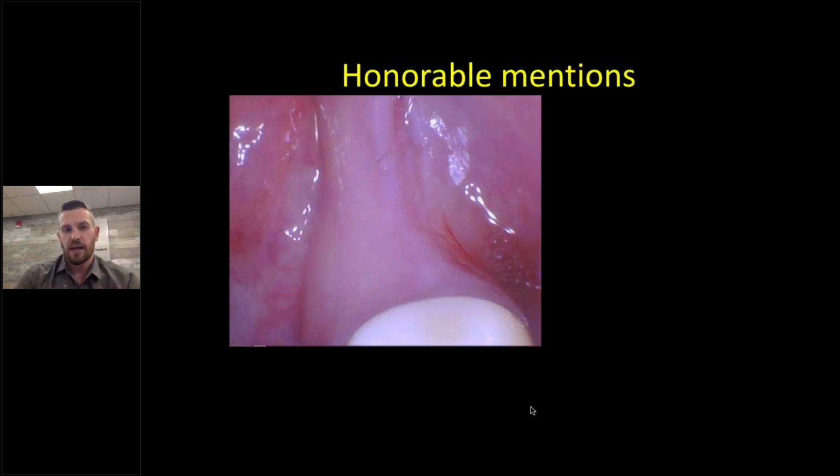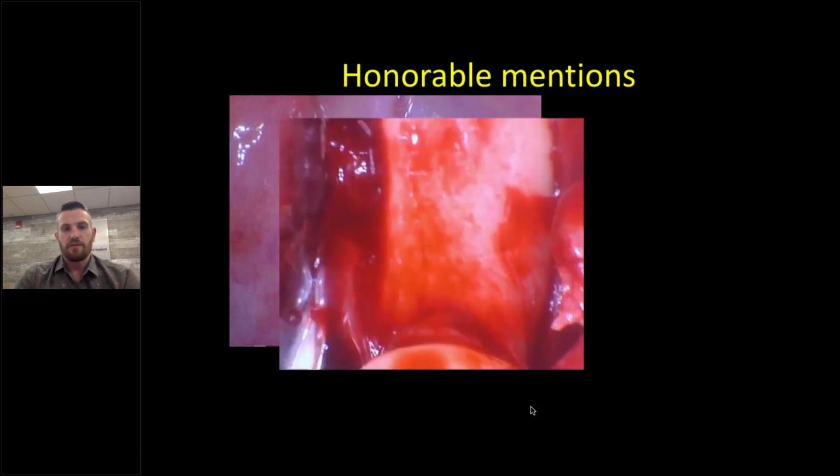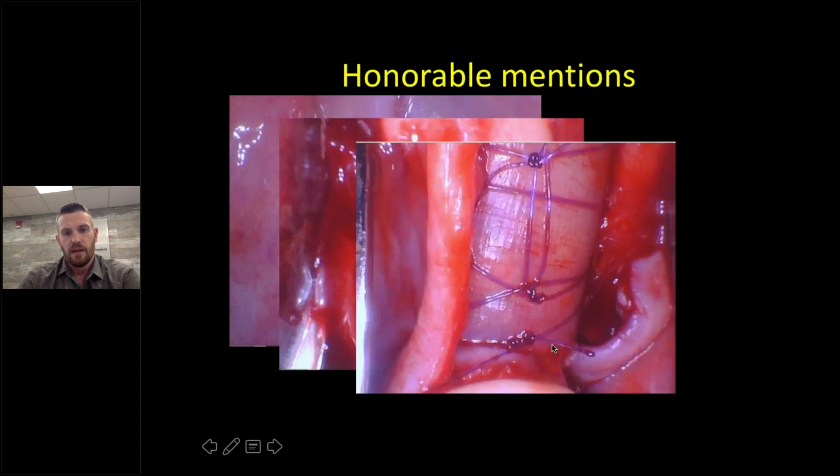So this is what it looks like intraorally, and again, like I said, this isn't a fully well-documented case. I did use an intraoral camera for this. After tissue reflection, we can see that cupping that comes from when you have a long-standing vertical and horizontal defect there. So we do our cortical perforations here, and we make our periosteal pocket, which is down here. And then I will take the larger laminar membrane and wrap it over and utilize that pocket to stabilize the membrane while I'm suturing it into the periosteum. And that's what it looks like when I'm doing it.